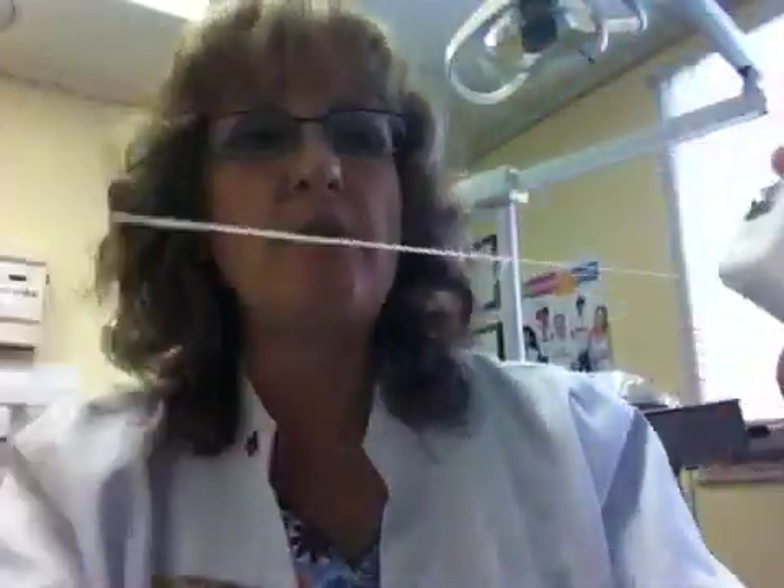Oh, one more thing — another thing we use is a floss threader, and that's for people who have braces or who have a bridge where you just can't go through the teeth. This is like a big sewing needle. You just put the floss through it and then you'll be able to thread it through the two teeth that are together and go underneath the bridge or underneath the wire of your orthodontic braces.